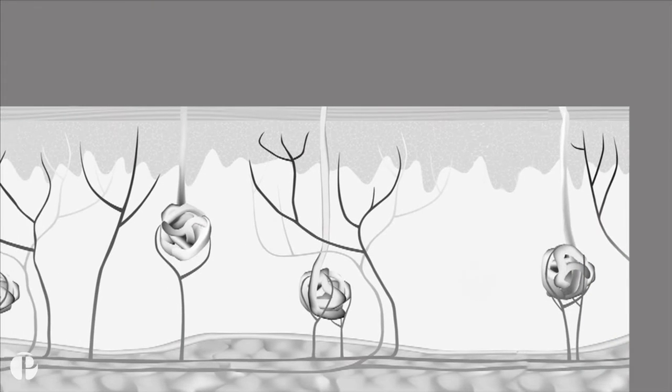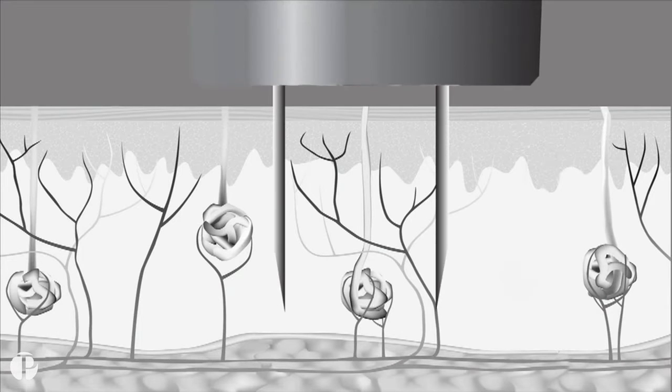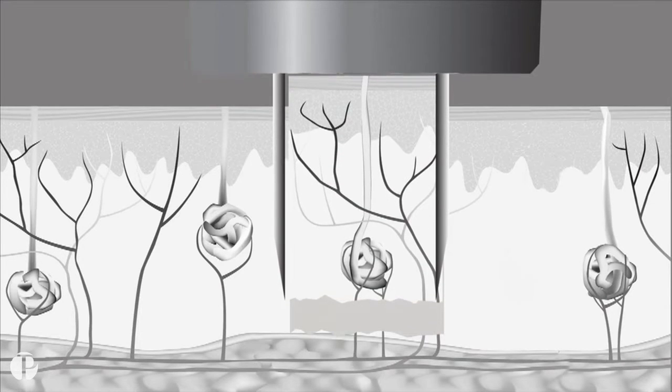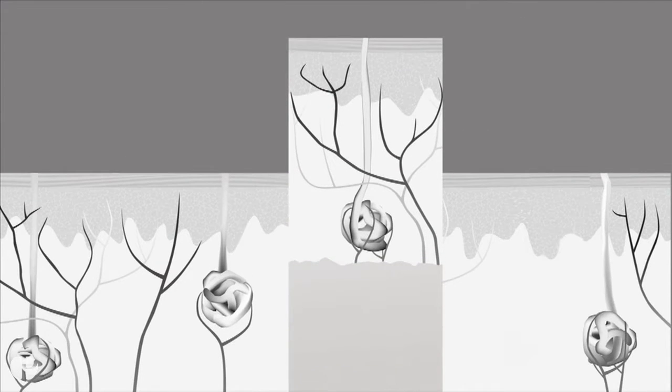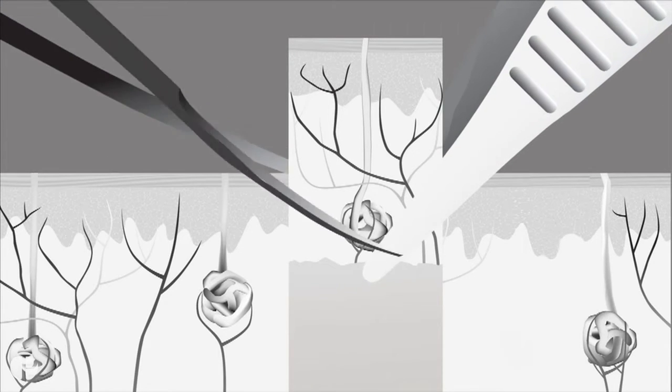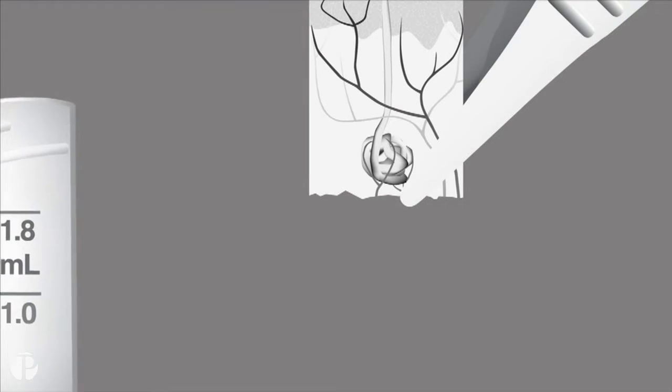The illustration now shows the metal head of the punch tool penetrating through the epidermis to the dermis to a depth of 4 millimeters. By going to this depth, you are capturing both the available epidermal nerve fibers and sweat gland nerve fibers. Again, it is important to grasp the sample from underneath the epidermis to avoid damaging the nerve fibers.